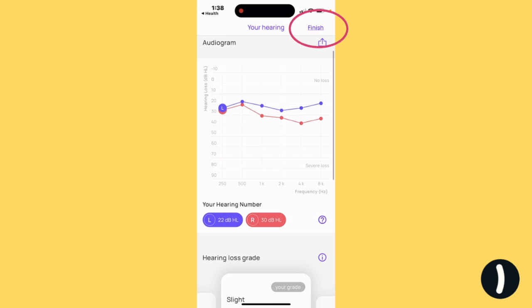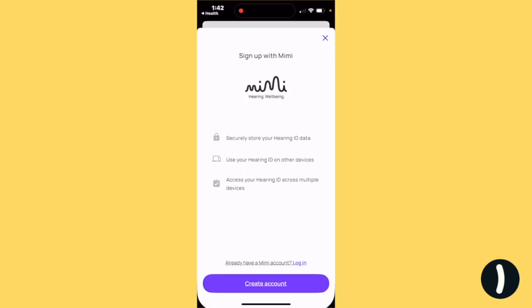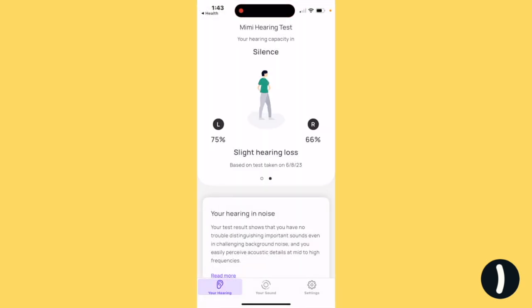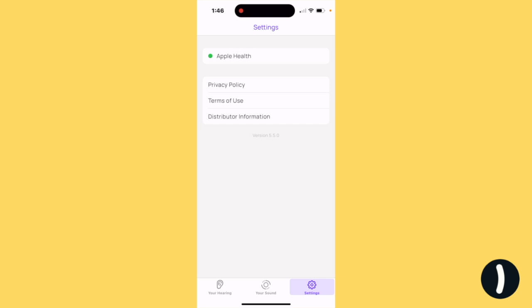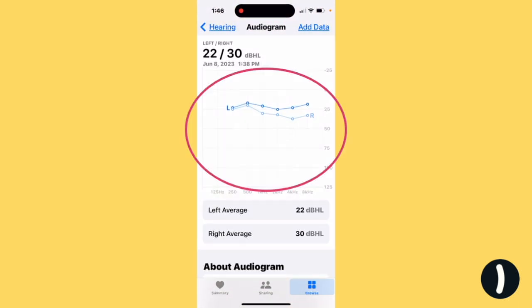Hit Finish. In order to save it to the Health app, you do have to create an account. I have an account already, so I'm going to log in. There's one more step: to connect Mimi and the Health app, go to Settings in Mimi and connect to Apple Health. Allow. Now when we go back to Health, our audiogram will be there.